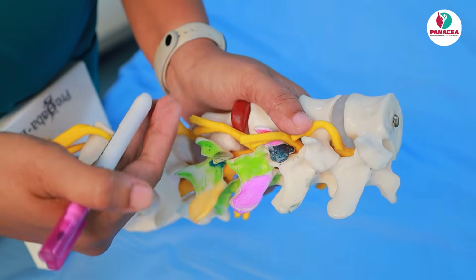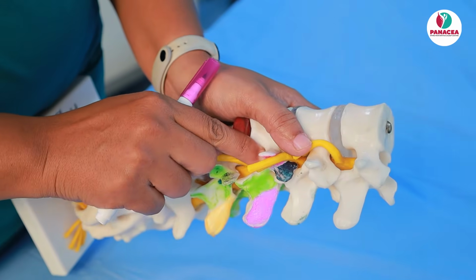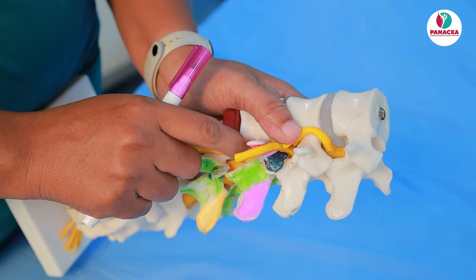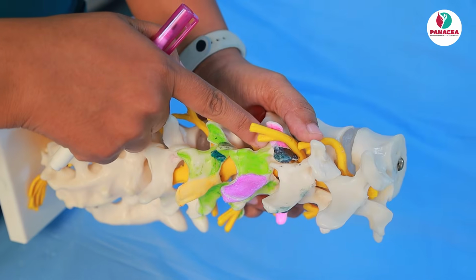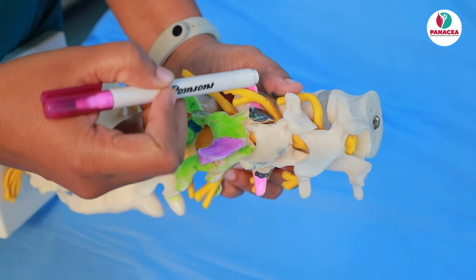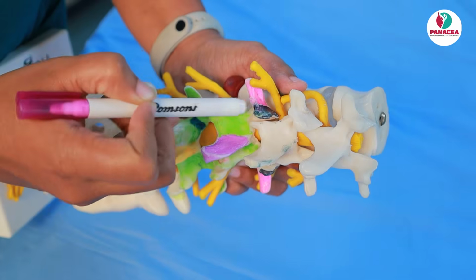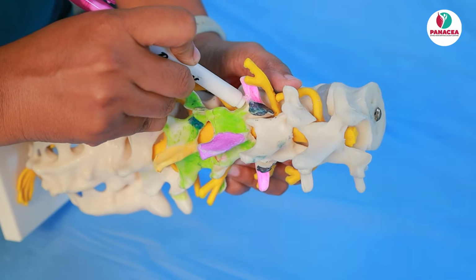In the transforaminal approach, the triangle formed by the lower part of the pedicle and the exiting nerve root is the safe triangle. We will be able to see it in the Scotty dog near the neck and chin part. If you are able to appreciate the Scotty dog, this is the mouth, this is the pedicle, this is the eye and this is the ear, this is the neck, that is the pars, and somewhere here near the chin we will be entering.